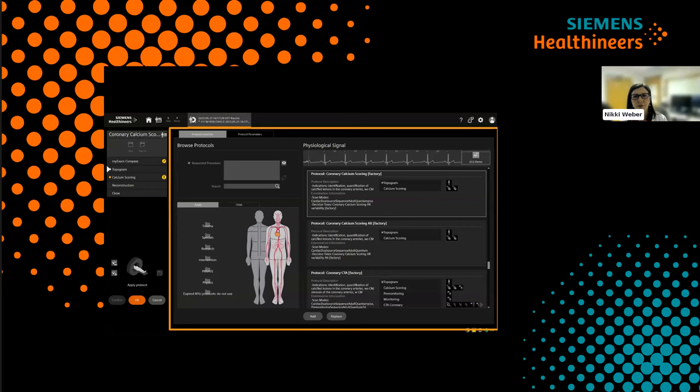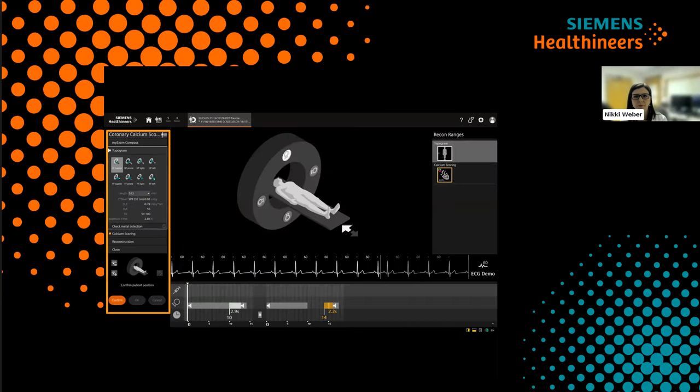Here you can see the protocol browser, the same familiar body regions for adult and child, separated vascular and non-vascular region models. There are also customizable folders on the left. The protocols are listed on the right. The protocols include an area for the descriptions or notes, available scan modes, and a selectable topogram. The protocol description area has been useful in our practice for technologists learning the new scanner and its protocols. As we optimize our protocols, we needed as many ways to communicate the changes as possible.